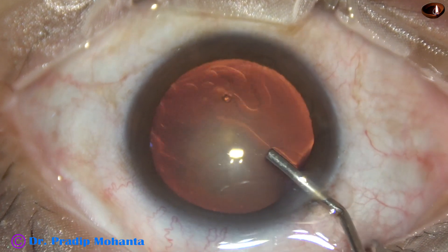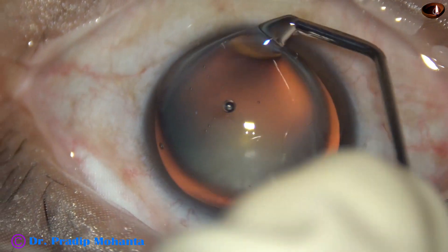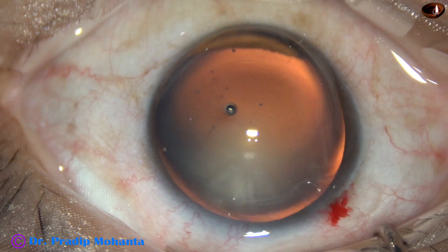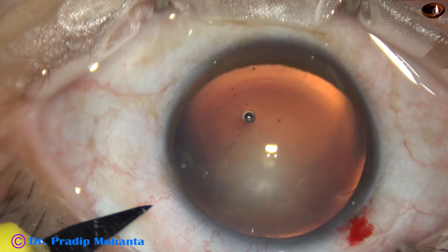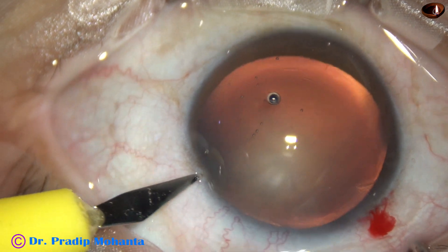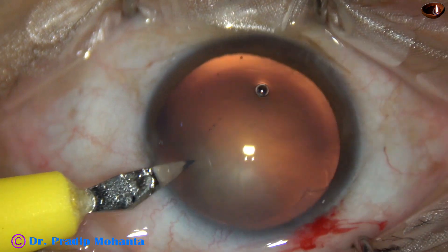Now the anterior chamber is filled up with visco. This is 2% HPMC, and it is applied over the corneal epithelium for better visibility. And now a side port is made on the left side of the main incision, about 3 o'clock hours away at mid-limbus.